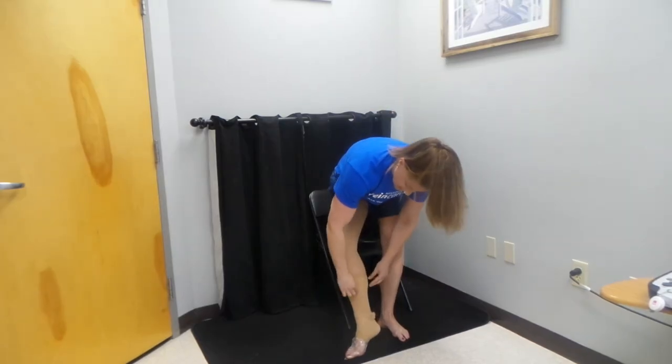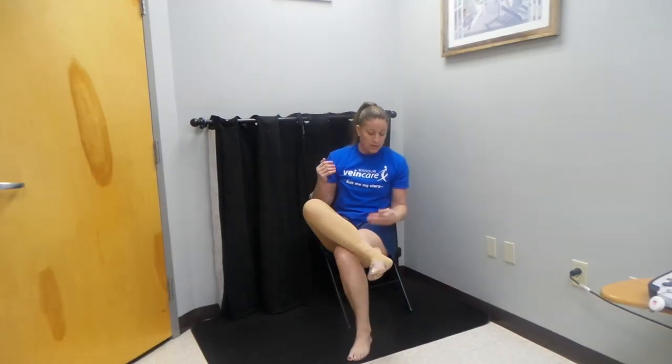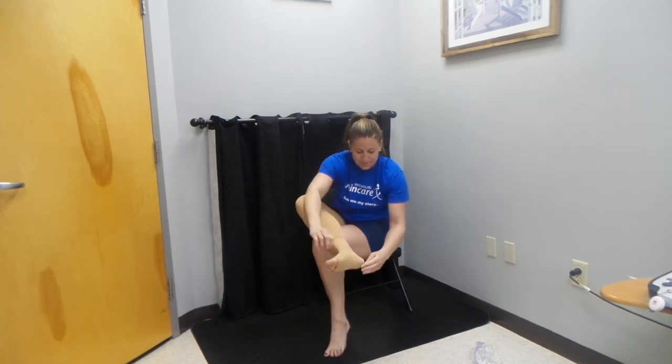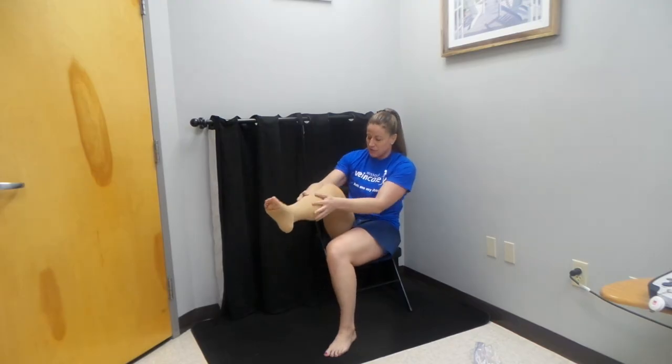There's a huge fold in this stocking right now and I want to work that down because that can be pretty uncomfortable. Now we've got to fix the bottom of the stocking. The heel is here — we want to get this plastic bag off first. So I'm going to pull the bottom of the stocking up over the plastic bag, slip it off, and then pull the stockings down. The heel is in line with my heel; I make sure that it's nice and smooth. And there you have it — all the best of luck to you.